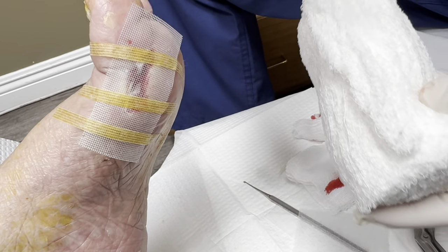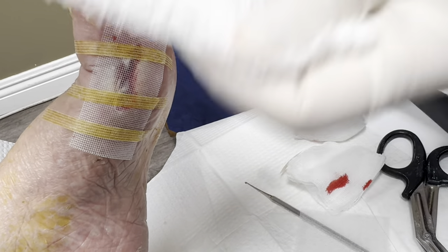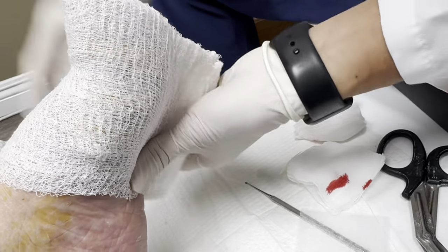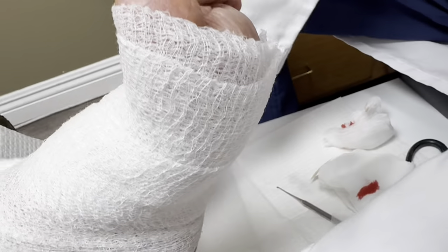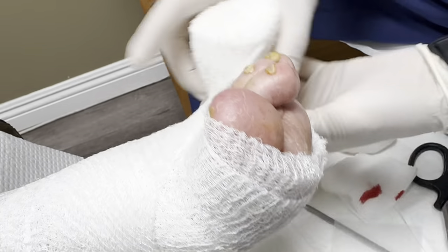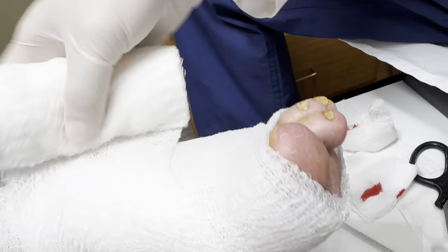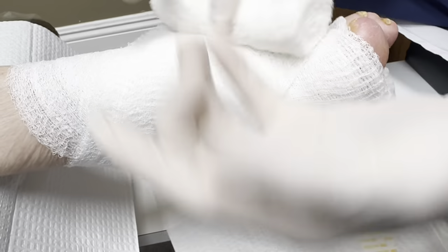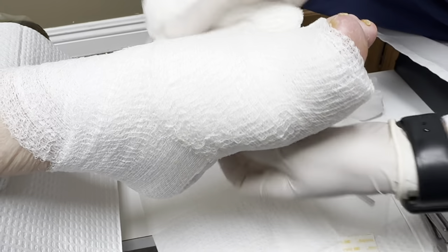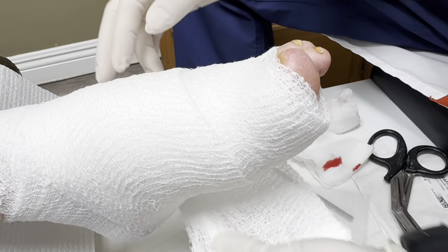It's going to regenerate all the new tissue. I'm going to wrap it up real quick, and they can change the top layer if they want to. We'll show you the progress over the next few weeks and hopefully it'll all fill in nicely. It works quite well and very quickly because the amniotic graft has brand new cells that will be coming up to the area to fill up the gap.